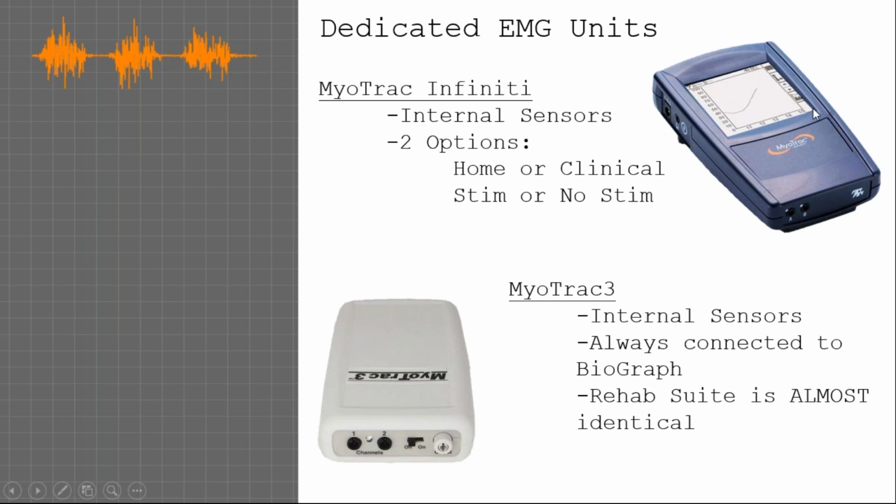So we'll notice on this unit that we have a touch screen on here. We can run biofeedback and get some audio and visual feedback based on the threshold on the unit itself. So again, we don't necessarily need to be tethered to a computer with this unit. The client can have it with them. They could be getting the audio feedback through headphones, and they could be working on, say, their maximum contractions. Built into the unit are also some protocols that are going to be work-rest protocols with different ratios of work to rest that do a certain number of repetitions.